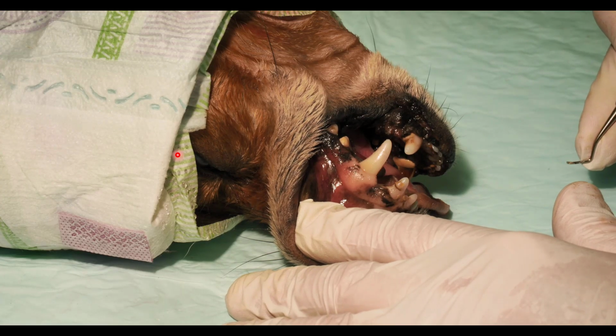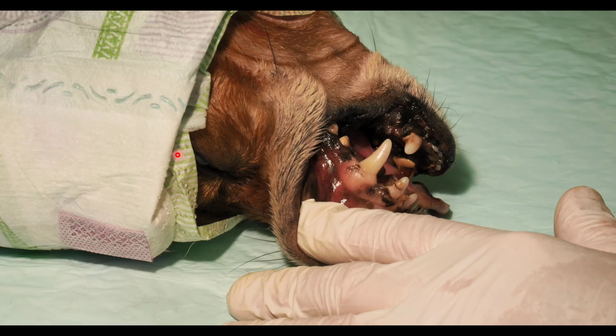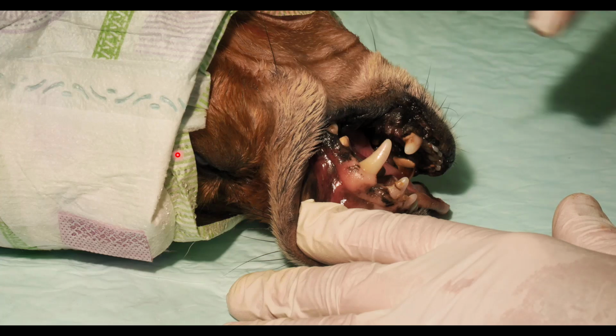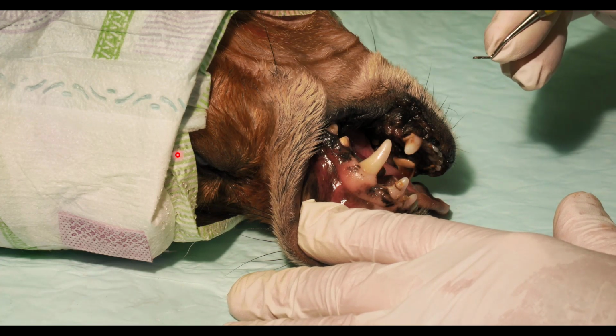So where do I do subgingival hand scaling? I do it in pockets that are 4, 5, or 6 millimeters in a dog. And of course, if they don't have horrible furcation exposure and mobility, etc. And then 2, 3, 4 in a cat. Those are the times that I'm going to be doing subgingival hand scaling. And the key is you need to charge for it.